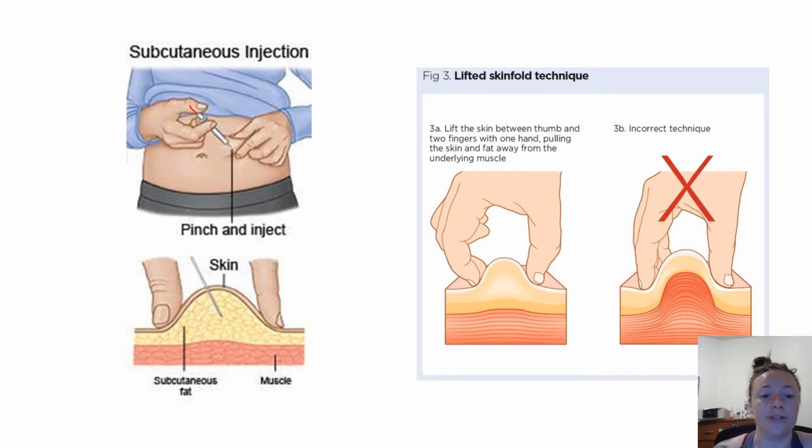This is a good illustration of a 45-degree angle. They're pinching their skin right here. This is what it's going to look like when you pinch your skin a little bit. Make sure that when you pinch your skin, you're not grabbing like a huge fat wad of muscle. You just want kind of like the soft, tender, flubby part of like your arm or your abdomen or your leg. So definitely just find some sites that are just a little bit more fattier than others.